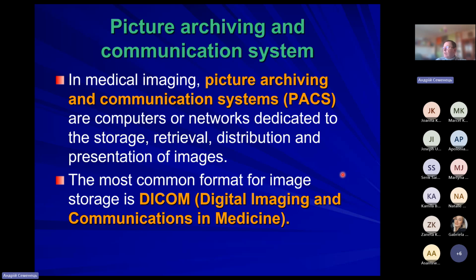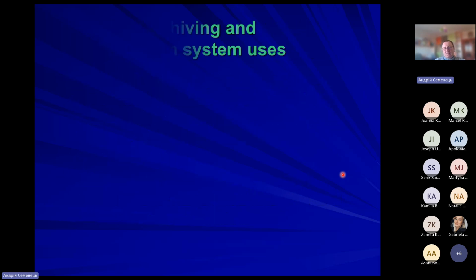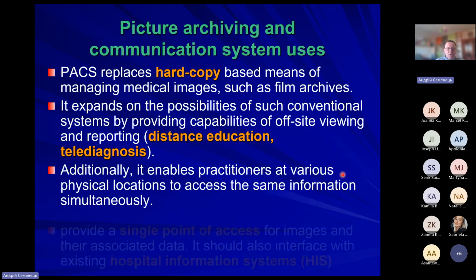And usually they are tightly related to DICOM, or Digital Imaging and Communications in Medicine, the international standard dedicated to managing medical images.